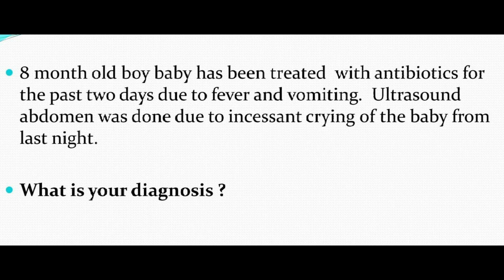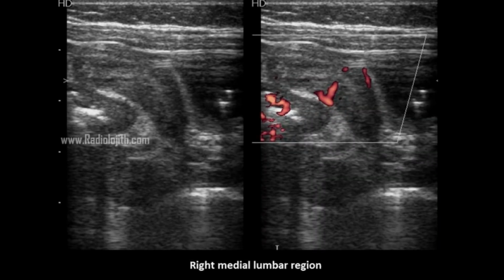This is about an 8-month-old baby boy who has been treated with antibiotics for the past 2 days due to fever and vomiting. Ultrasound abdomen was done due to incessant crying of the baby since last night. You see the images and give your diagnosis.